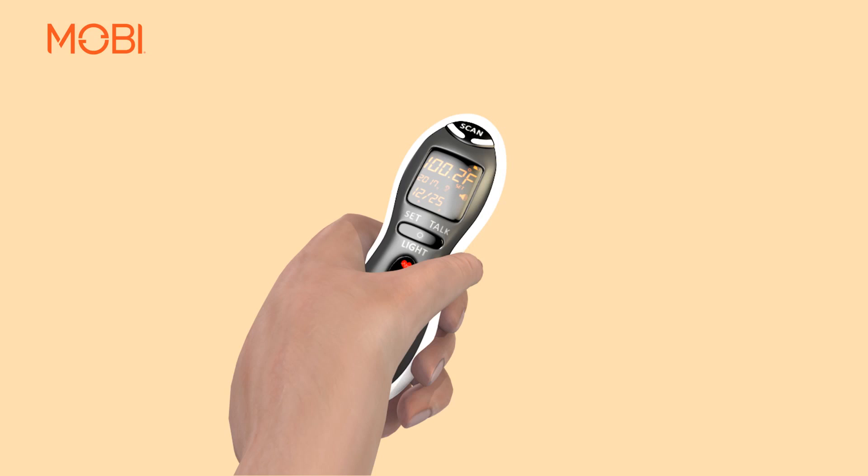the display will show the body temperature in large numbers, either in Fahrenheit or Celsius, depending on the setting.